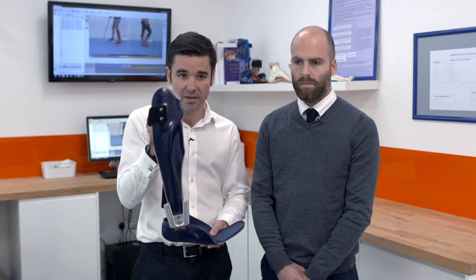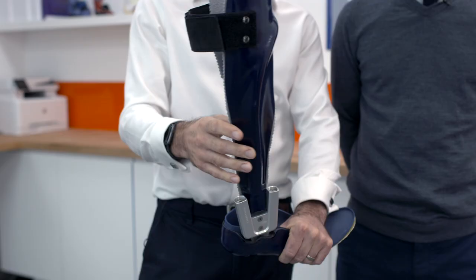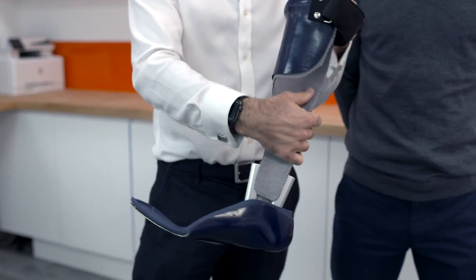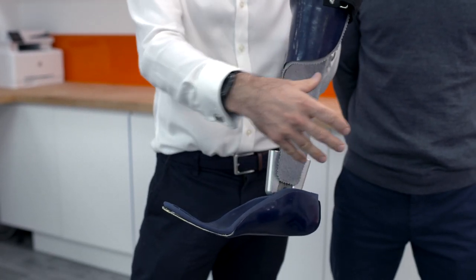We're finding this orthosis is incredibly beneficial — patients love it because we can really optimize their gait pattern. It's carbon fibre, it's very lightweight, it's a really functional device.